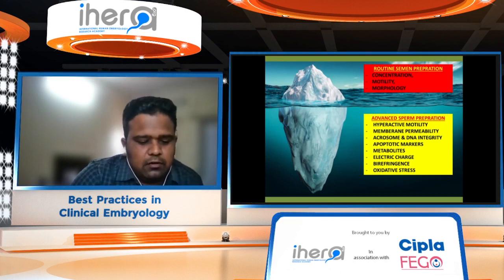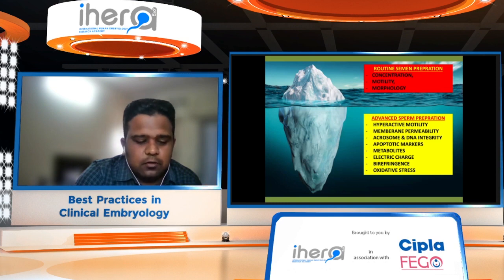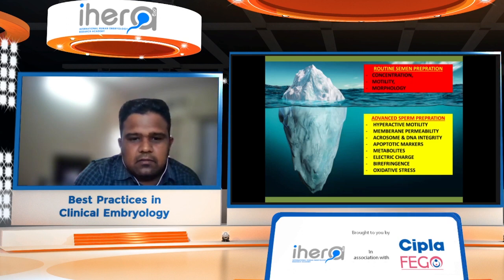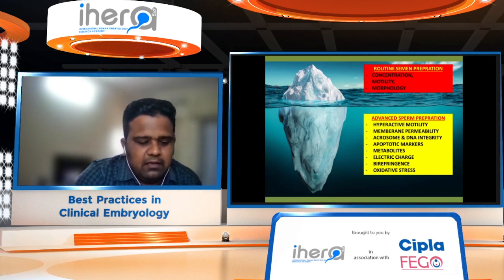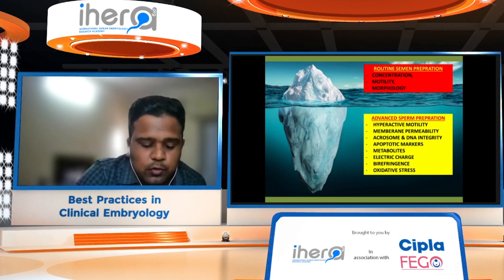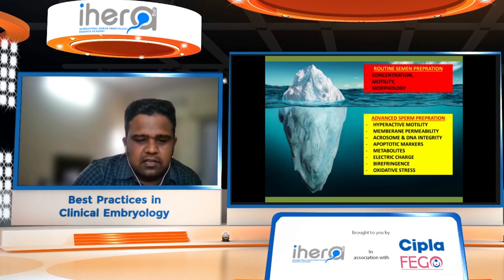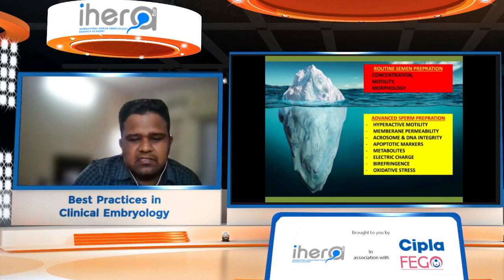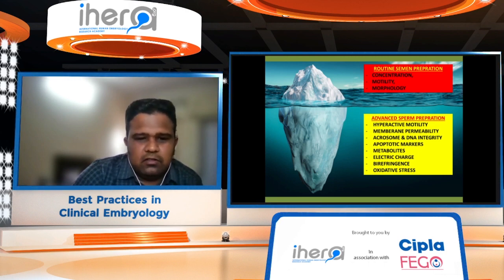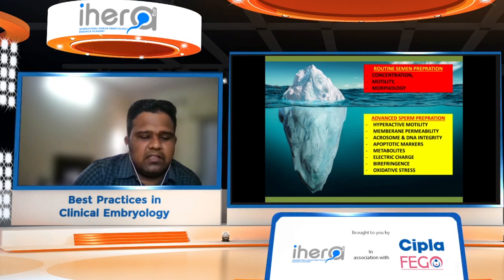To conclude, I would like to comment that advanced sperm preparation techniques have the potential to successfully replace the routine semen preparation methods. But for that, we need to keep our mindset ready on when, where, and how these techniques need to be implemented and executed. Special expertise and knowledge is required in both methods, whether conventional or advanced. But ultimately, what we see on the tip is that the basic seminal parameters are selected for the methods of sperm preparation.